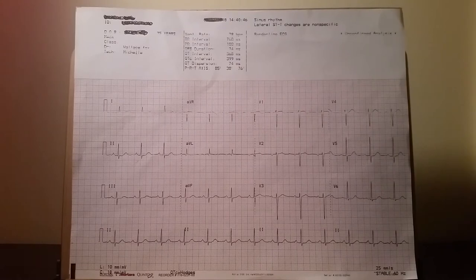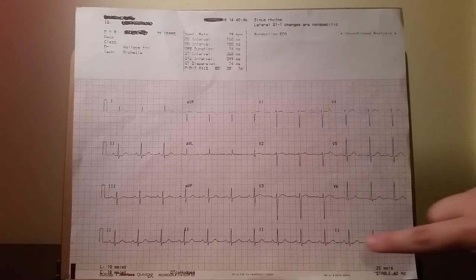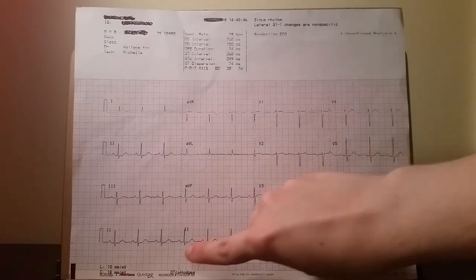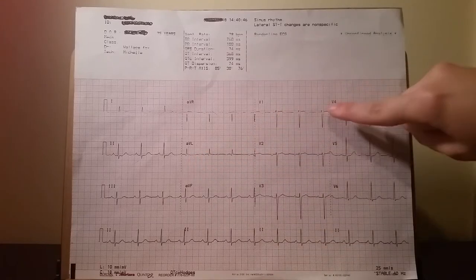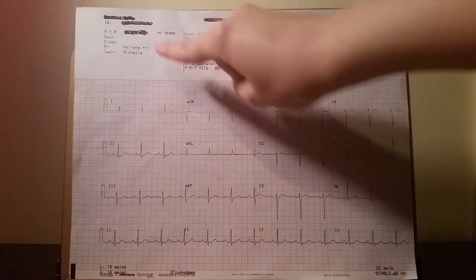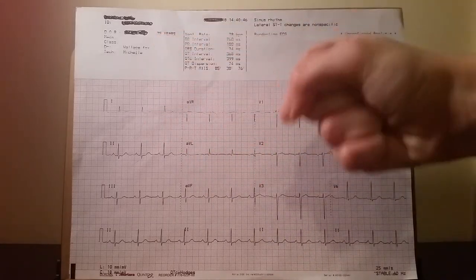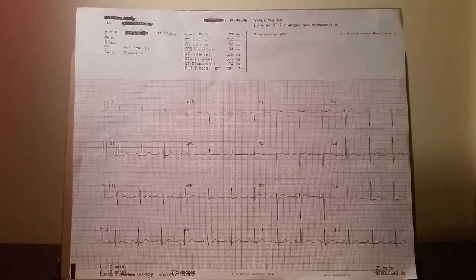Here is a sample EKG. Without quite a bit of training, it is difficult to see how different anatomical locations of the heart correlate with the EKG leads on a standard 8.5 by 11 inch EKG.